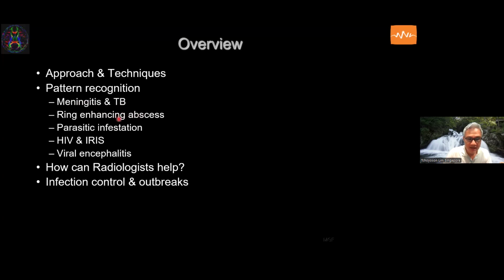We have abscesses and other non-abscess ring-enhancing lesions, including parasite infestations, which are not uncommon in the global south, viral encephalitis, and finally HIV and IRIS, which is a phenomenon that sometimes occurs. We'll talk a bit about how radiologists can help in an infectious disease outbreak and the infection control procedures, specifically for COVID-19 as an example.